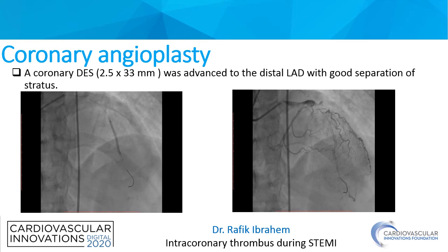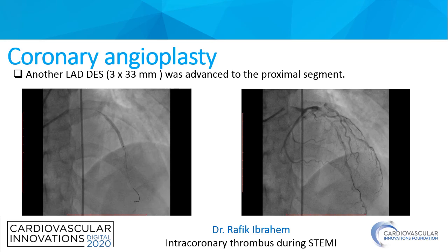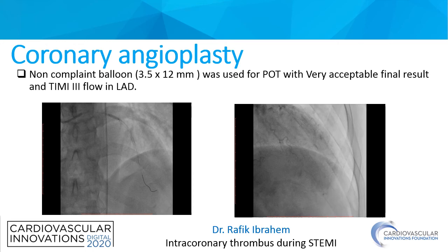We used a coronary drug-eluting stent 2.5 by 33 mm advanced to the distal LAD with good separation of struts. Another drug-eluting stent 3 by 33 mm was advanced to the proximal segment. Then a non-compliant balloon 3.5 by 12 mm was used for POT, with a very acceptable final result and TIMI 3 flow in the LAD.